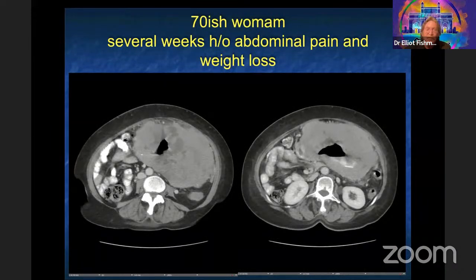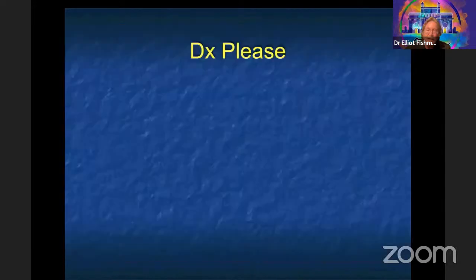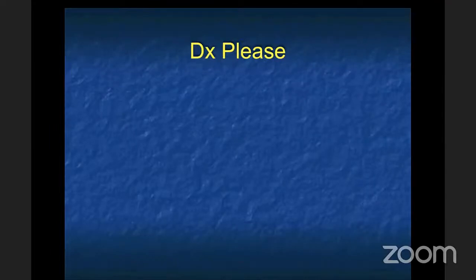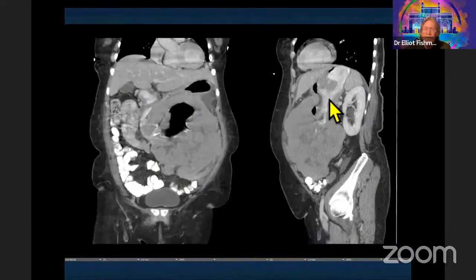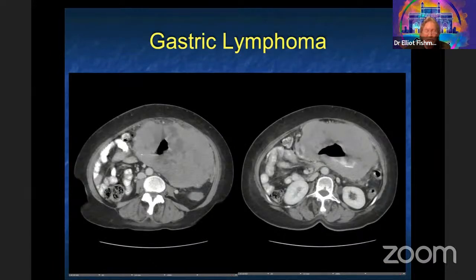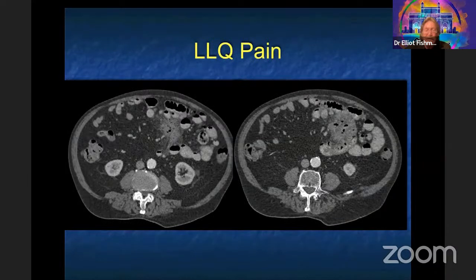Getting away from the cecum: patient with abdominal pain and weight loss — looks very similar, but it's more the stomach. Answers suggesting GIST — good thought. When you realize it's really a big ulceration in the stomach: gastric lymphoma commonly ulcerates and can be very bulky. My first thought would have been that it's an ulceration, but this was a really nice example of gastric lymphoma.